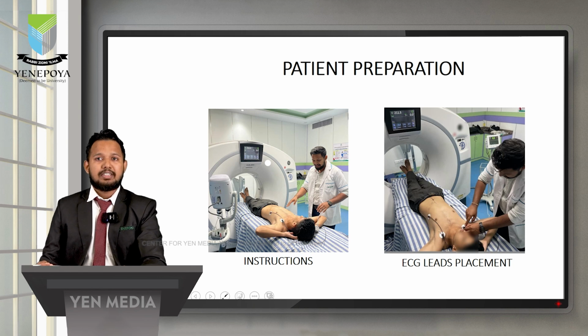Also, one important thing which we have to see is the gating. The electrodes should be placed properly in the 4 regions, namely RA, LA, LL and RL. RA electrode has to be placed below the clavicle on the right side, LA electrode has to be placed below the clavicle on the left side, LL electrode has to be placed on the lower left abdomen and RL electrode has to be placed on the lower right abdomen. Once this is done, we'll move ahead to the positioning of the patient.